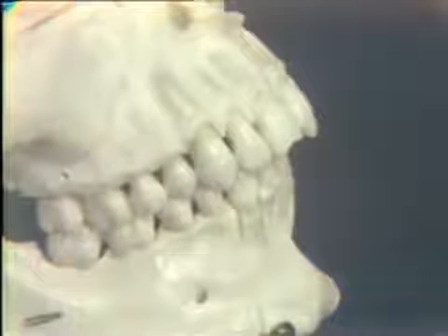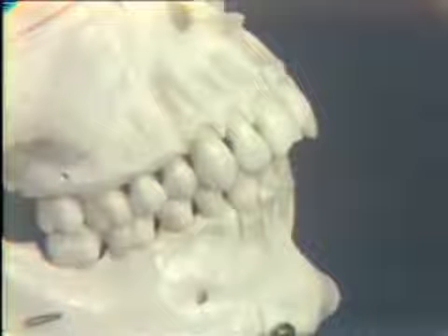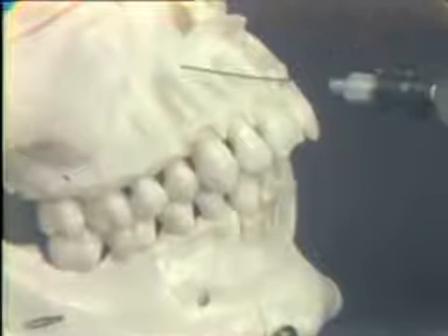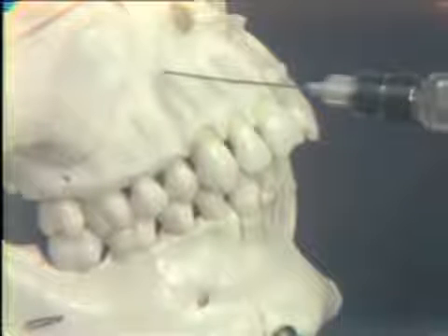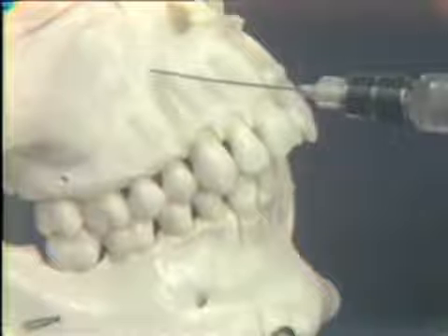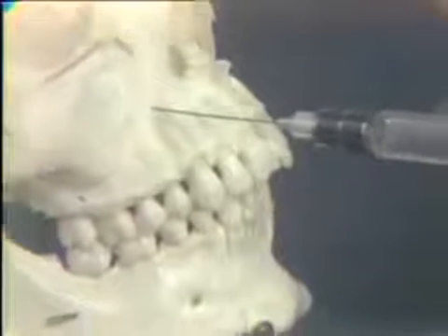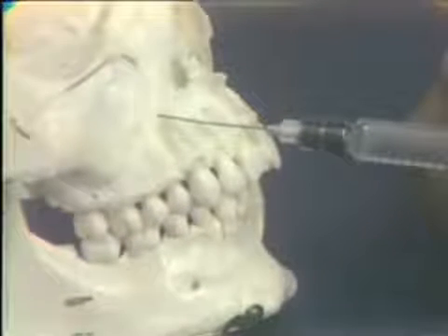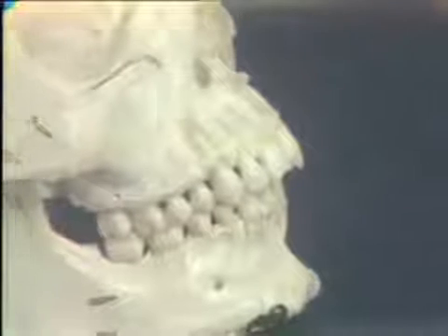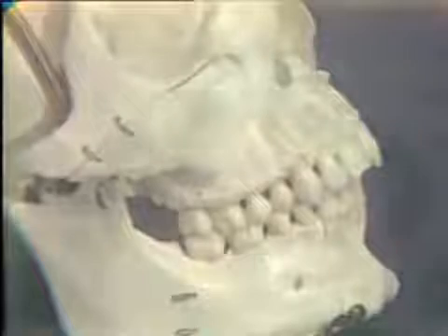Labial infiltration, mouth half closed, lip grasped and retracted laterally, so the vestibular tissues are again tense and taut. Needle directed superiorly through the vestibular tissues and quickly carried to bone. Aspiration and injection of 1.5 cc's of solution will anesthetize the maxillary cuspid very nicely. Now let's show it on the patient.